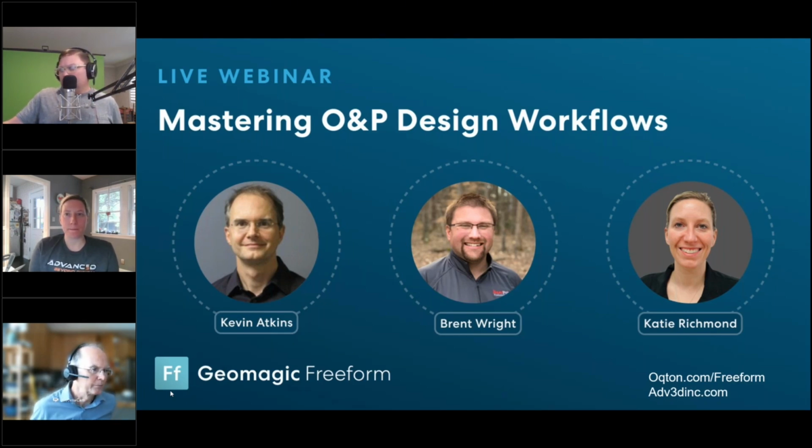All right. The lattice question, we'll answer that one separately from Vivek. Thank you, Vivek. Yeah. There are going to be better options in 2025 for some of that, and we're talking about 3D lattice, so not just rib style lattice. I think, yeah, beautifully designed. I'm sure that was aimed towards Katie's prosthesis and Dynabot, and I would 100% agree.